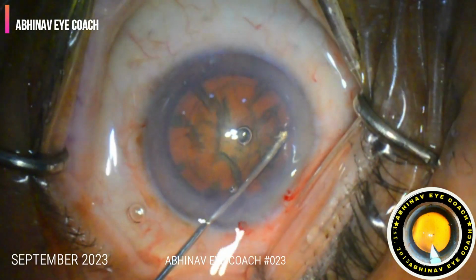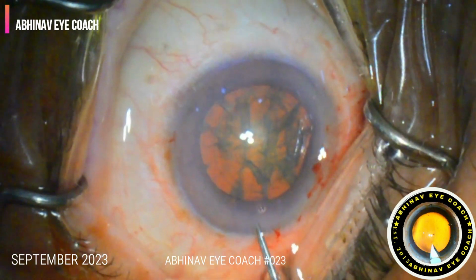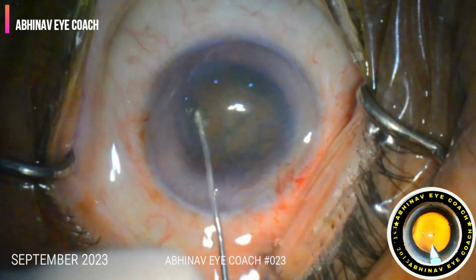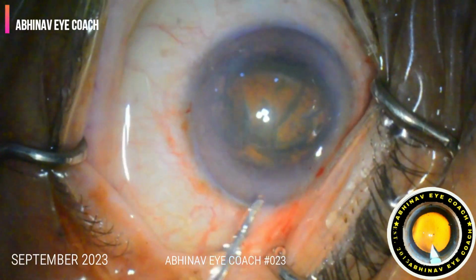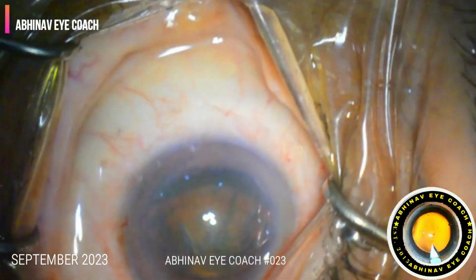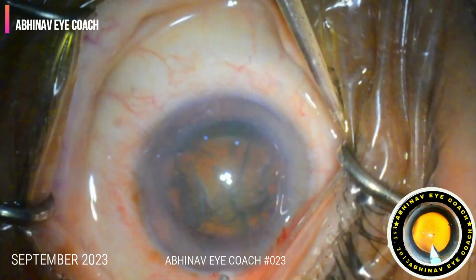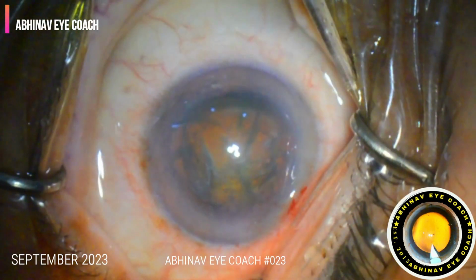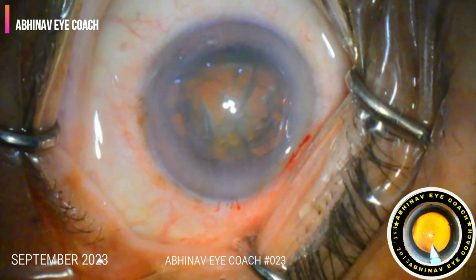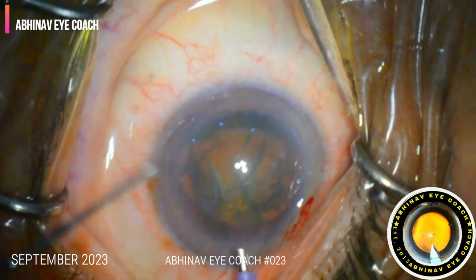So the nucleus is prolapsed out of the bag. Routine phaco emulsification is performed. The nucleus is prolapsed out of the bag and a little bit of viscoelastic OVD is injected behind and in front of the nucleus. Routine phaco emulsification is performed.